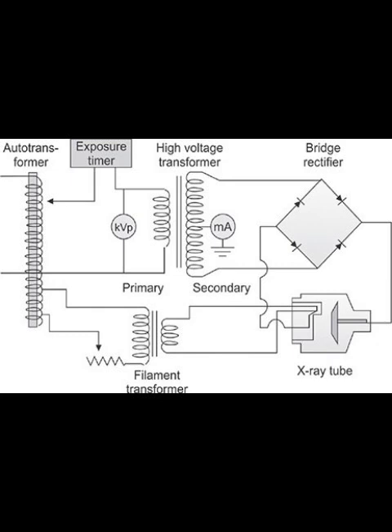So it's like a fine-tuning dial before the main power boost? Yeah, it's a great way to put it. It gives that crucial flexibility for image quality in different patient anatomies. It's really key for diagnostic accuracy.